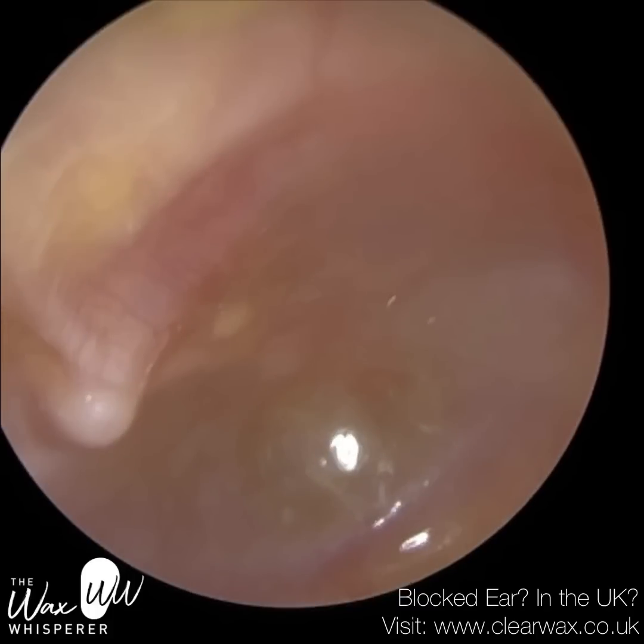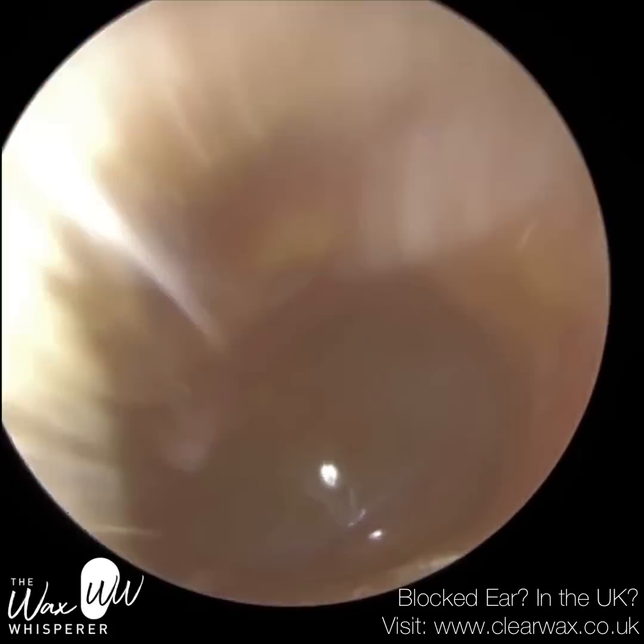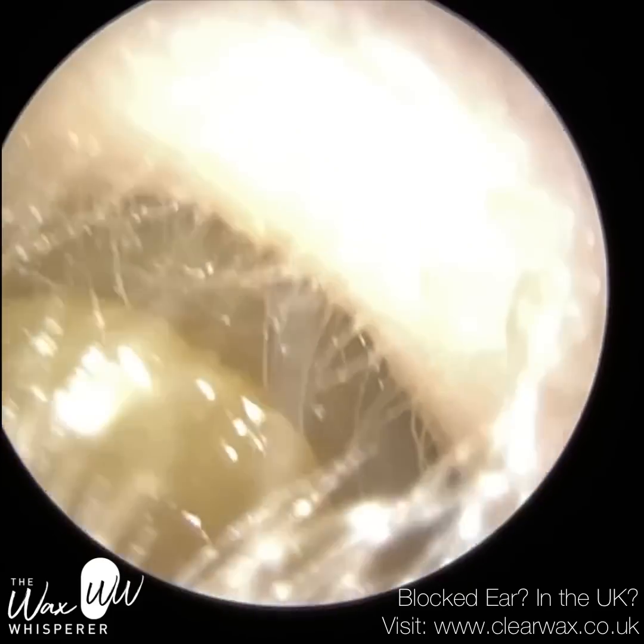So this is patient 1's left eardrum. It's retracted — you can see the eardrum's sucked in. The top part of the hammer bone is protruding out, so it's prominent. The eardrum's red, dull, and inflamed.